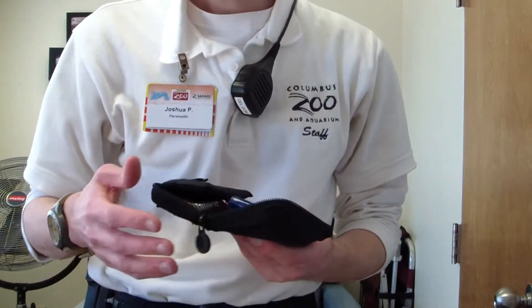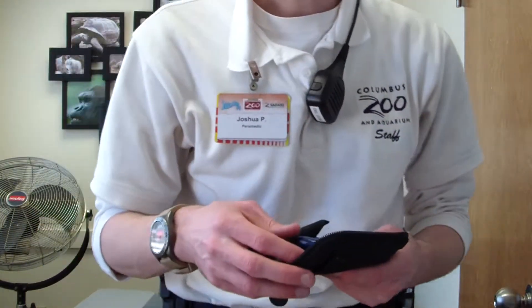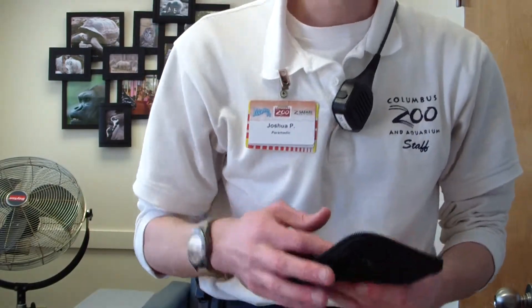So for today, I wanted to do a little demonstration on how to take blood glucose. Blood glucose is basically how much sugar is in your blood. It's a good way to find if somebody has passed out for some reason or not feeling good, so it's just a good way to determine that.